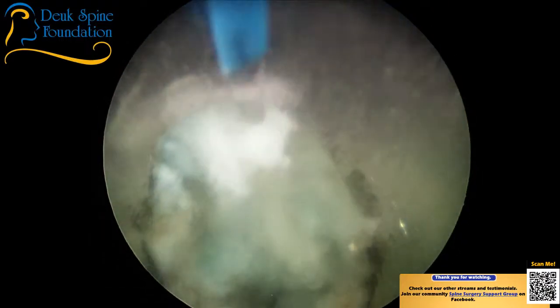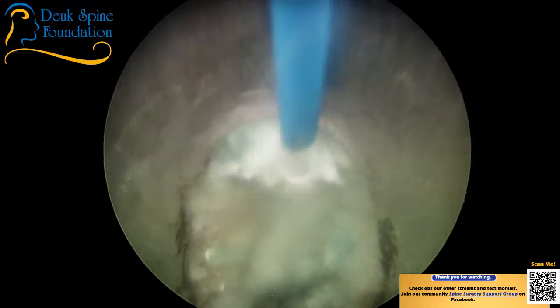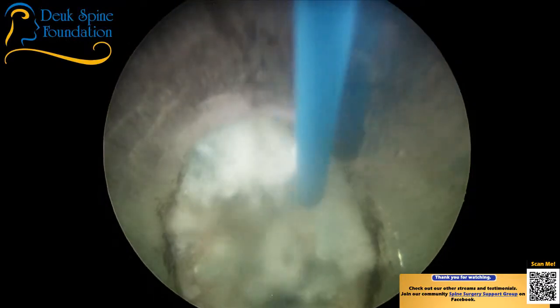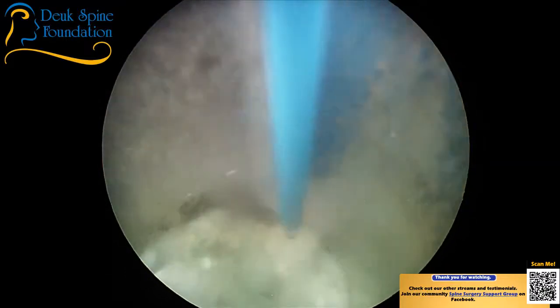We've got her laying on her belly. We're giving her pain meds at times. So we have to be cautious about how we interpret our results. And then the 3-4 disc I couldn't even test because I'm not in the disc. We're just outside of it.